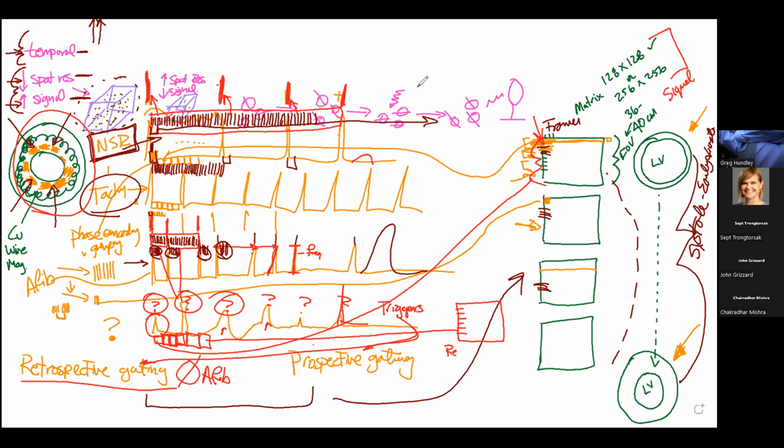So in real-time imaging, the spatial resolution is lower. The other thing, look how wide these boxes are. The temporal resolution is low. And because you're collecting the whole box, all of this space at once, within the box, the voxels and the pixels, the signal is low. Okay, so that is a fallback.